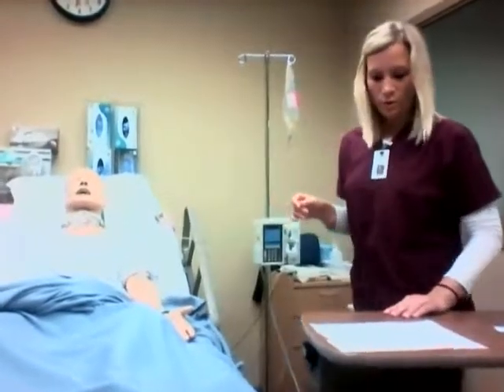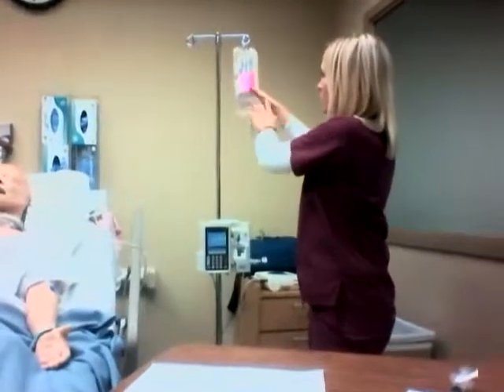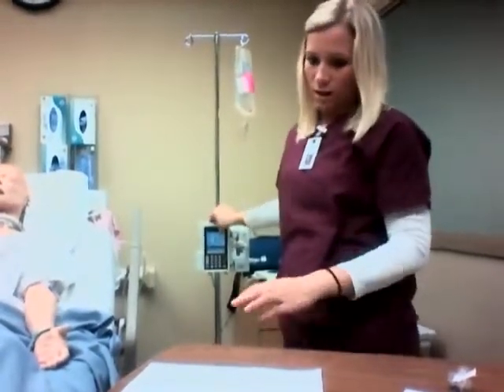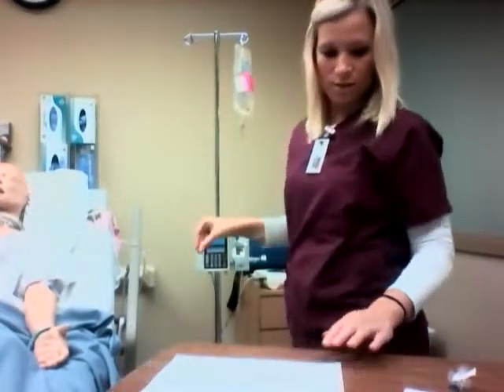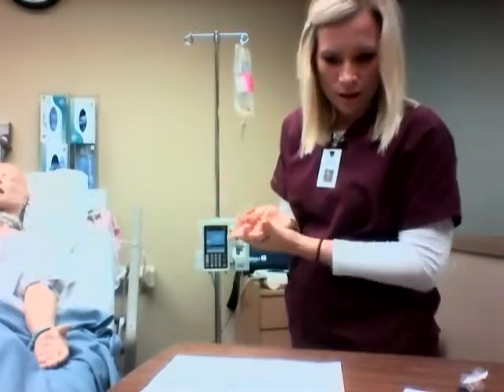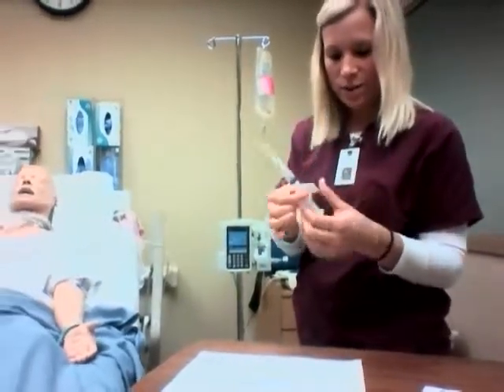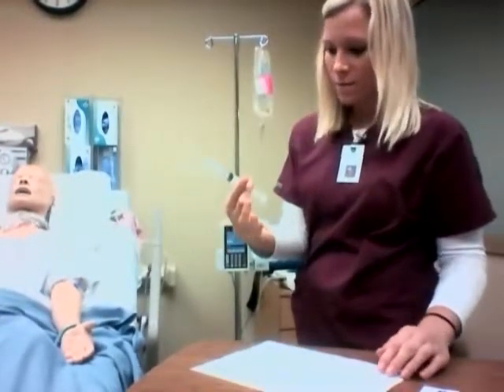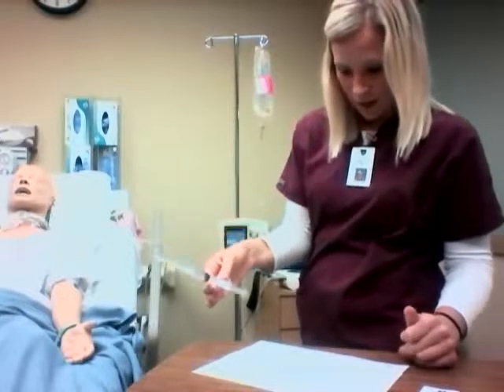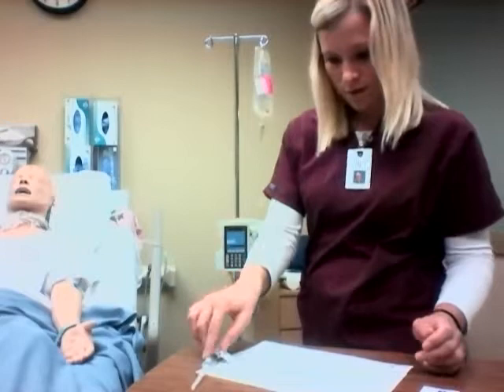So I am going to also verify that the medication hanging is normal saline, and it looks like it is, and it is flowing at 125 milliliters per hour. So I'm going to wash my hands, and I'm going to verify that this is the correct medication. The Cardizem 25 milligrams per 5 mils. And it's for the right patient, I'm giving it at the right time, and it is the right route.